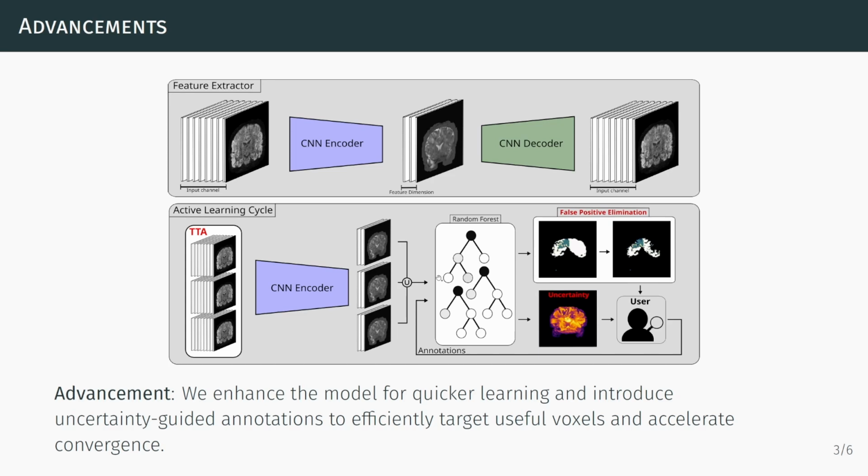On top of that, we've implemented anomaly detection using isolation forests, which help reduce false positives that occur when generalizing from sparse scribbles. Specifically in background regions, we found this to be quite helpful.